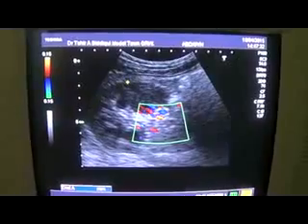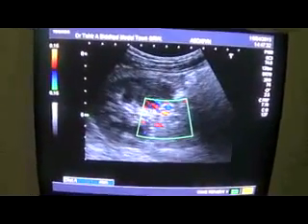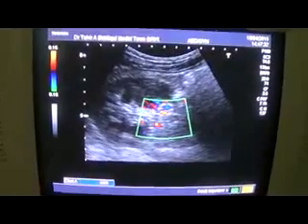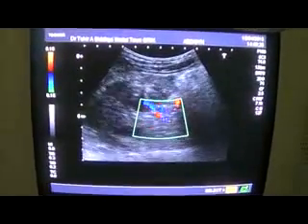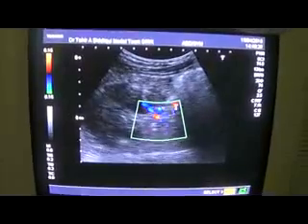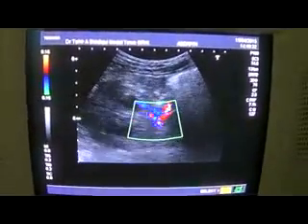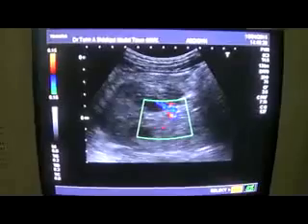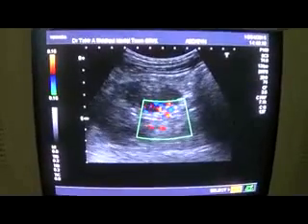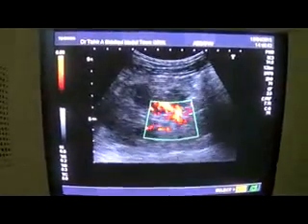Cortex is normal and no calculus is seen. This is the hilar region where you can see the vessels entering and leaving the kidney. In the hilar region, the renal artery and renal vein can be seen. Now applying the power Doppler.